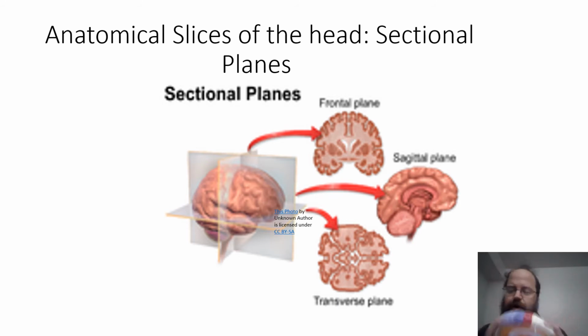And finally, the transverse plane is looking down from the top down towards the bottom. Again, not as common, but for certain problems, they may wish to do that, the transverse plane, which is slicing in this direction. Again, all these manipulations are done by the computer, and as computers have gotten faster, they provide different ways of looking into the skull.